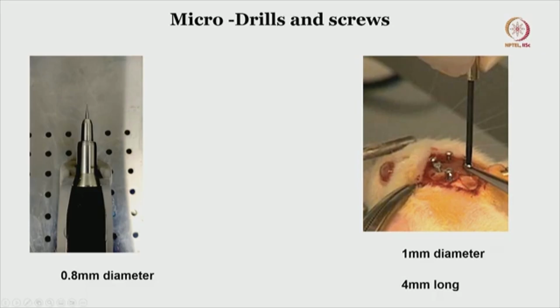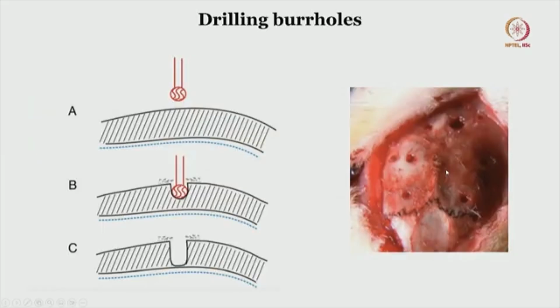Implant the stainless steel screws, wherein you leave a gap between the surface of the skull and the top of the screw, so that the cement, your dental cement or any metabond adhesive layer that you are going to use, can occupy this area and form one unit along with the primary implant. So, this is another very important step that one needs to practice.